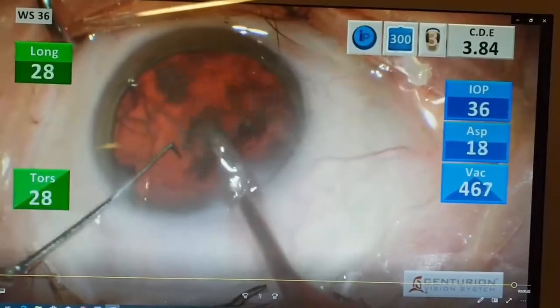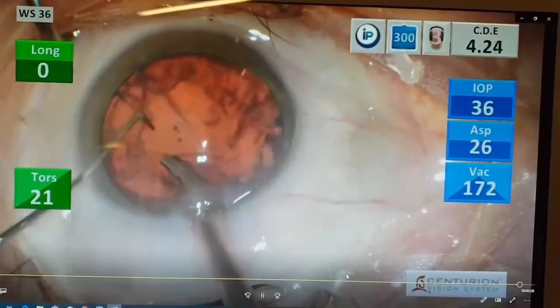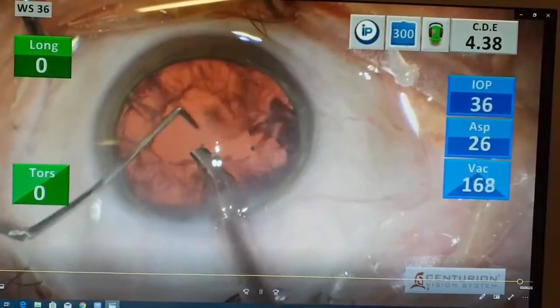Consuming these small fragments will give us better stability, less damage, and less iatrogenic stress on the zonular system.